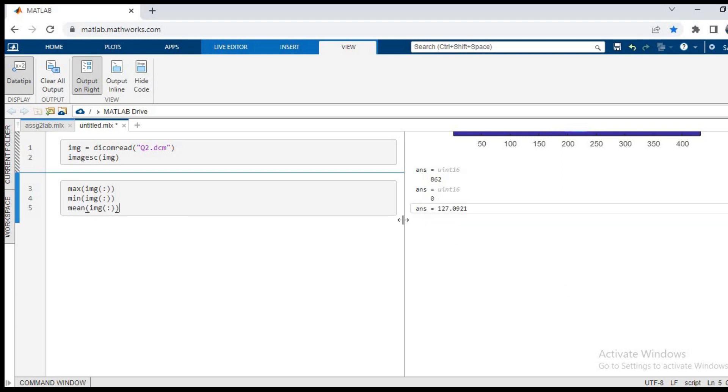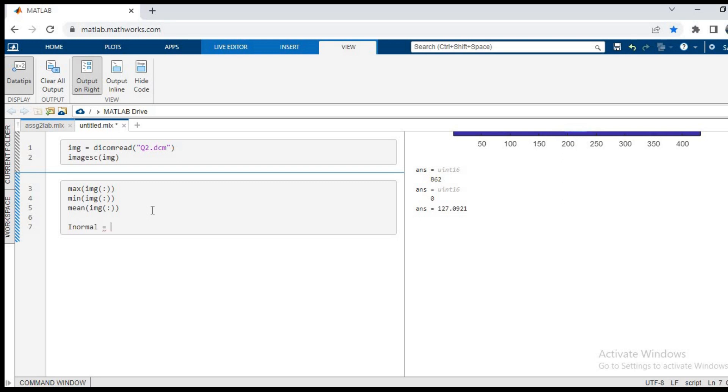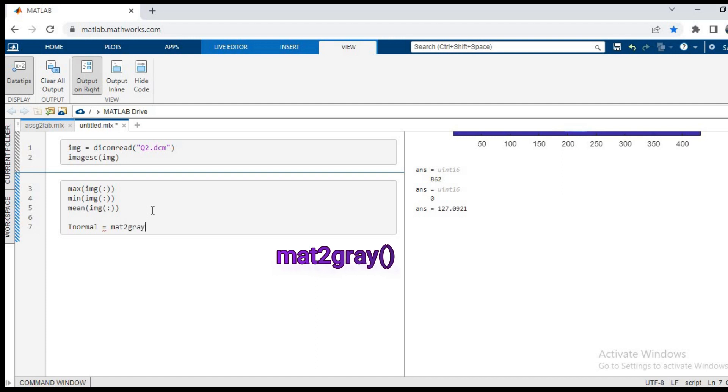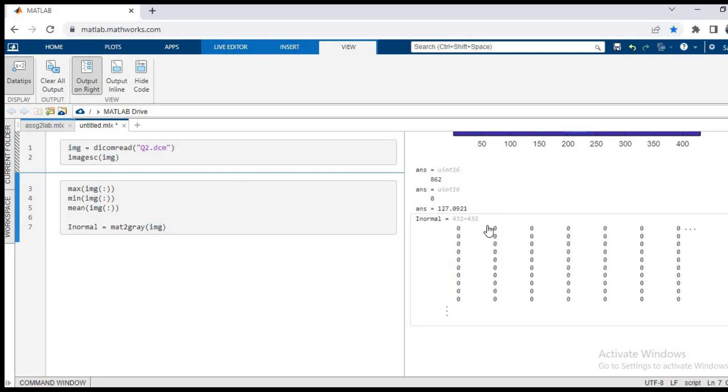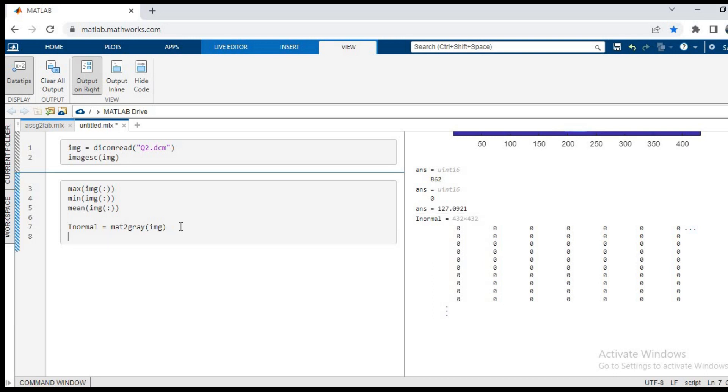For that we will need mat2gray function. So I will write i normal is equal to mat2gray, and in the brackets I will pass the img, the matrix which I have read from the file. This will convert my image to a normalized image. As you can see in the output folder, the matrix has been created.